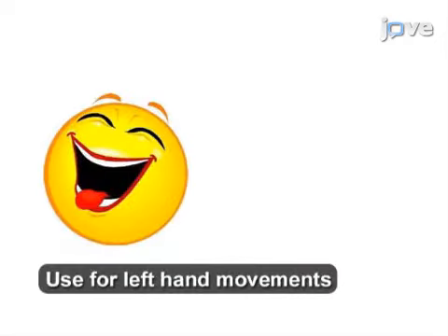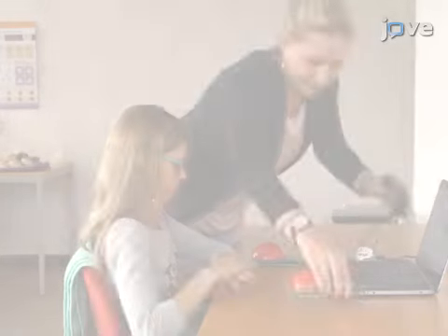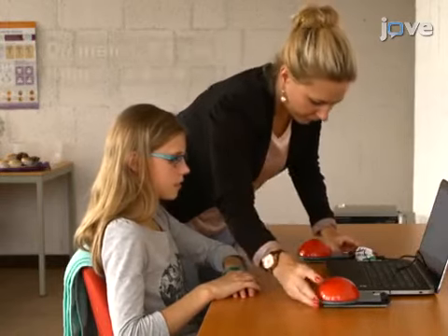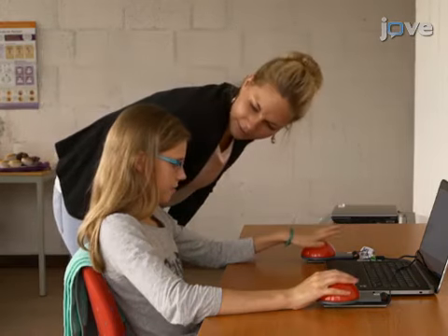Present the stimuli to the left or right side of the screen to respectively induce left or right hand movements. Include a background stimulus to the other side of the screen to control for stimulus lateralization. To register responses to the stimuli, provide the child with 2 big response buttons with very low response force requirements to ensure that children are easily able to respond.